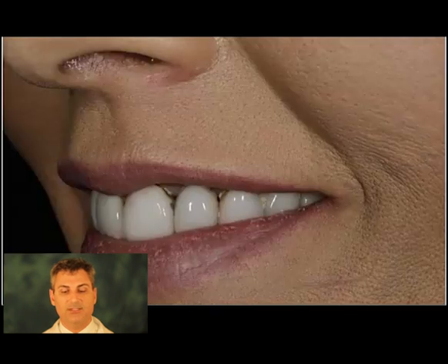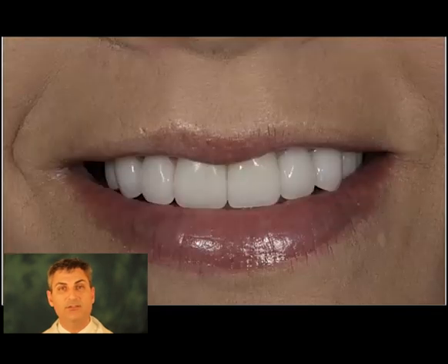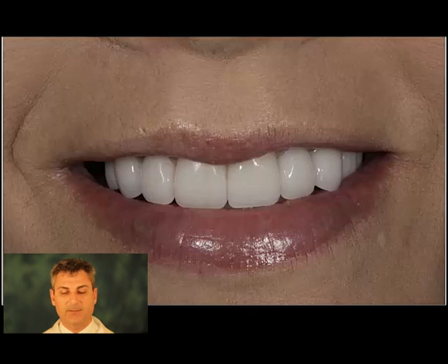From the other side you can see that she is an 8 to 10 tooth smile, is what her smile displays. Only using a lab that is very, very talented and can make the veneers look like natural teeth. There's usually 3 or 4 colors blended together. The tips of the teeth are a little bit translucent or see-through, and towards the gum line might be a little bit more yellow to look like natural teeth.